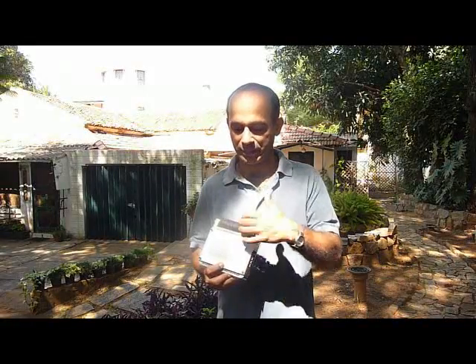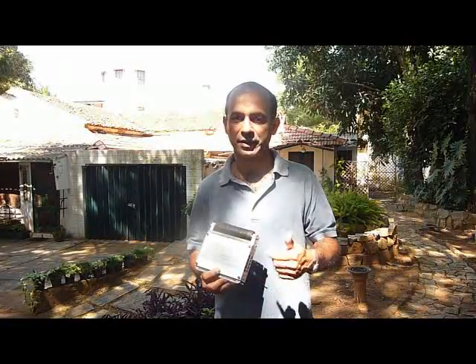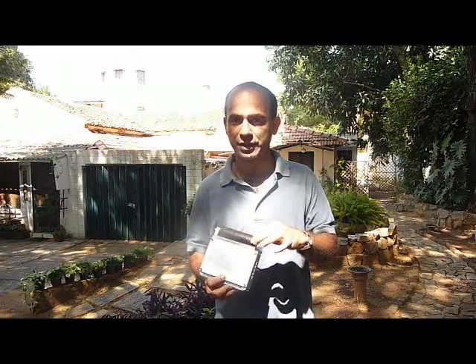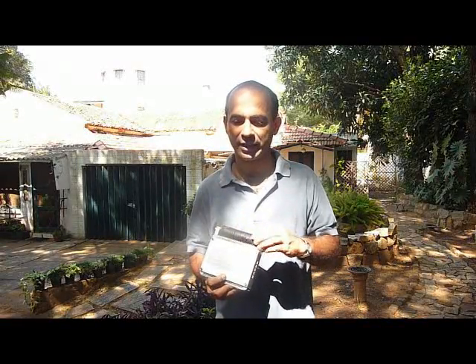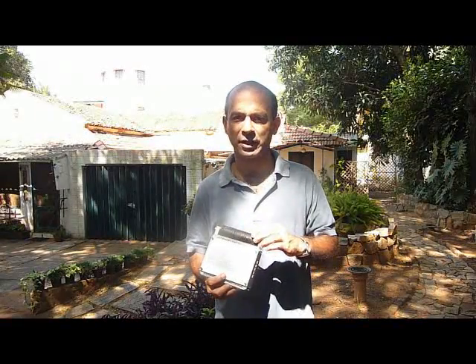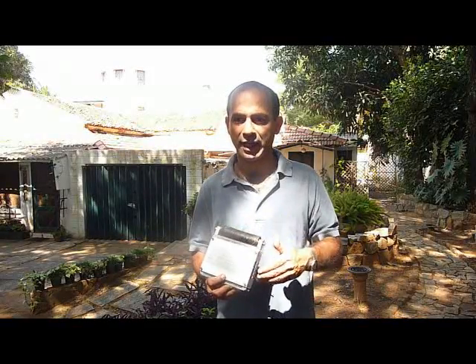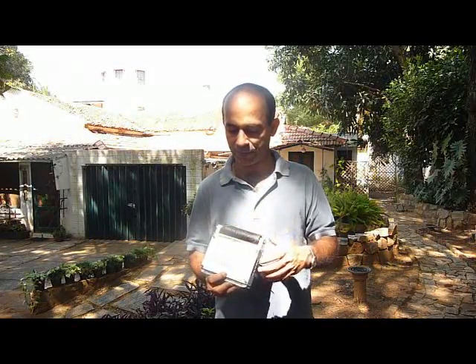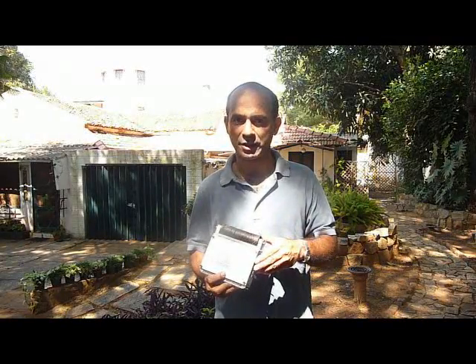So I'll be taking this part, and then you'll get to see what goes on underneath the top plate in the next few clips. This whole device, the cam portion of it, is similar to a musical device, a Swiss music box, and in the old days what used to be called a pianola, where a cam would actually trigger and activate the entire music box. So you'll get to see a comparison between those two as well.